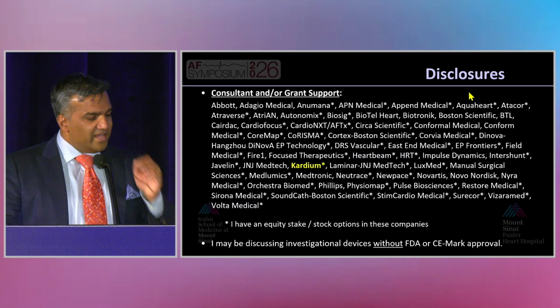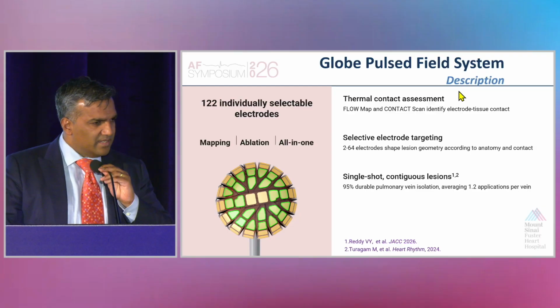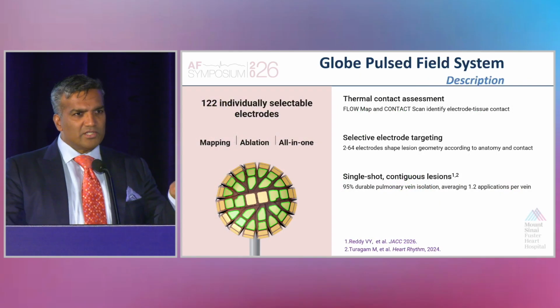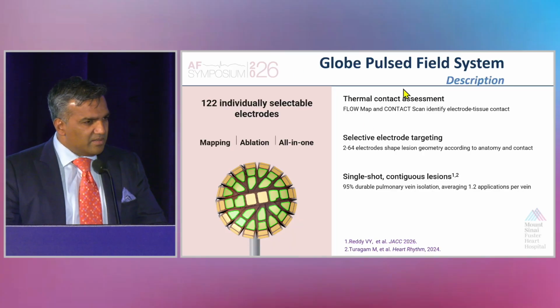My disclosures. Now, this device does have regulatory approval in both Europe and the United States. But the approval in the United States is mainly for PVI isolation. What we're going to show today is PVI isolation, but also linear lesions, and that would be off-label use, just to let you know. So let me just describe the device.